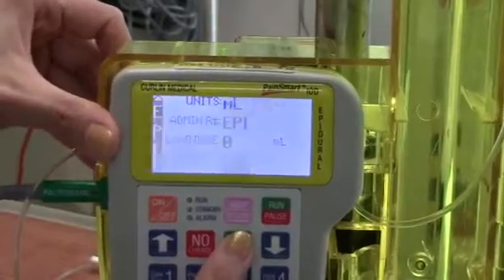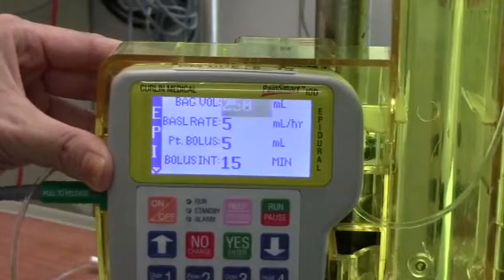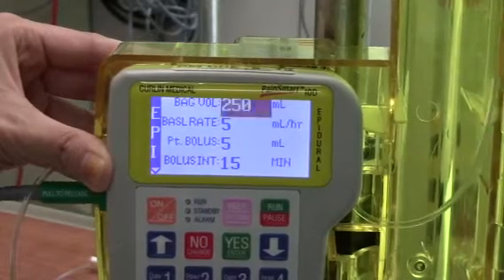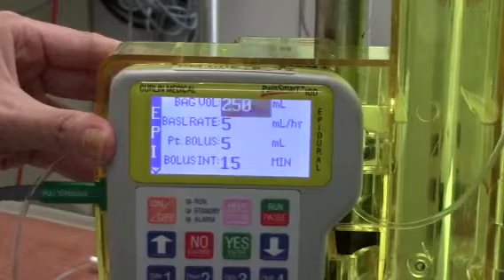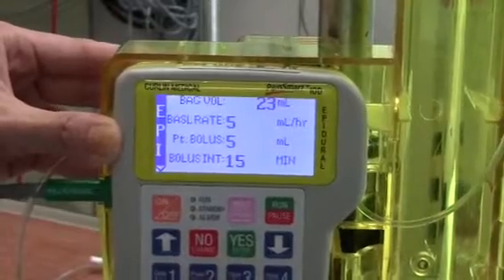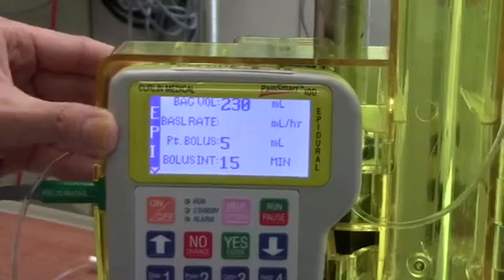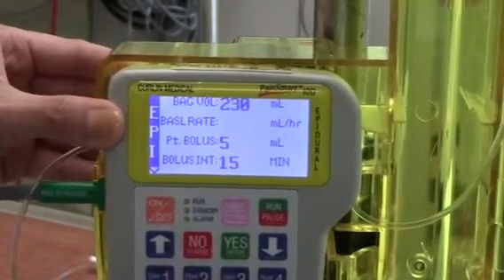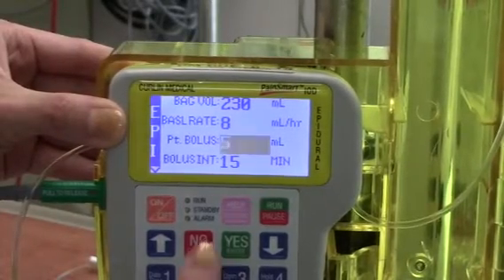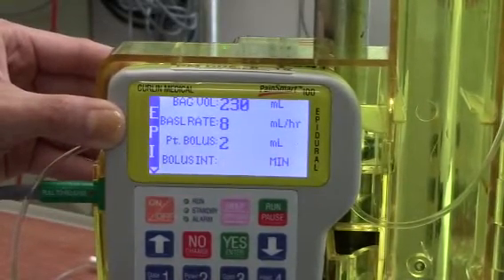We have no loading dose. One quick thing to note: the bags come in 250 ml. Only program about 230 ml, because you do not want the bag to run dry. The demand is 2 ml, and the bolus interval is 15 minutes.